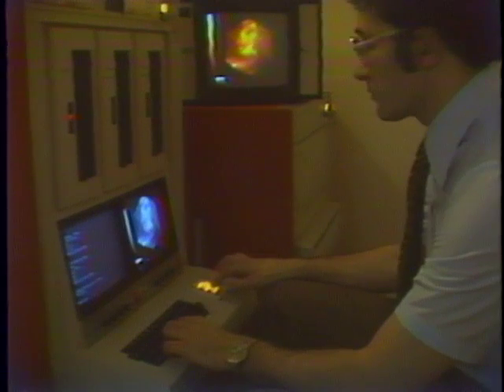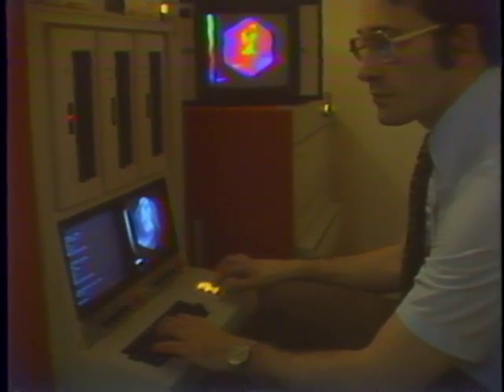The gamma camera has the ability to collect its picture images because of energy generated by radioactive isotopes taken by the patient. The information is collected by the camera and is transmitted to a computer which records a video disc and can play back at the will of the technologist and the doctors who use this diagnostic tool in a relatively new field of medical practice called nuclear medicine.